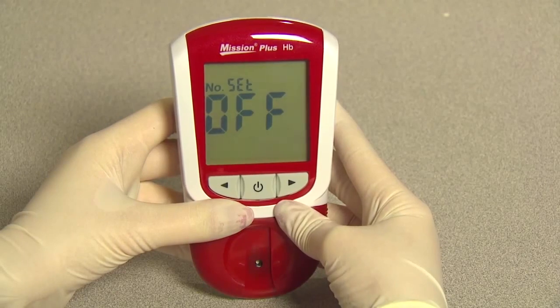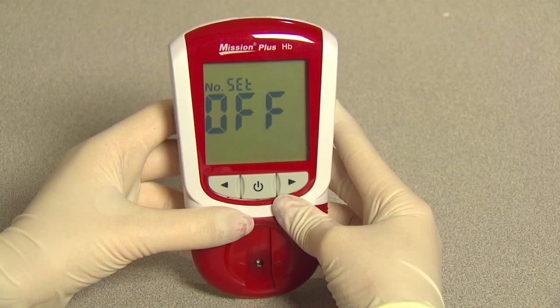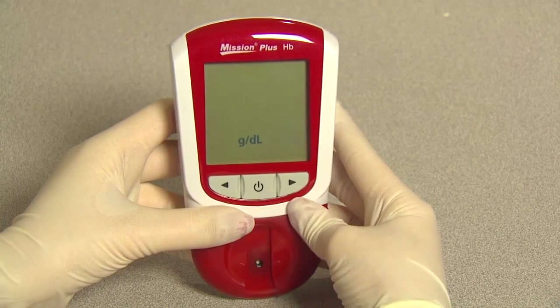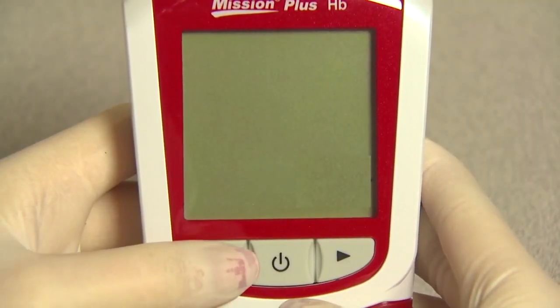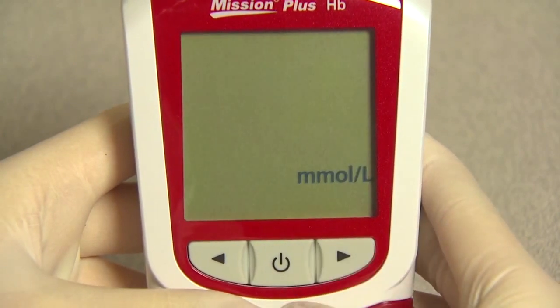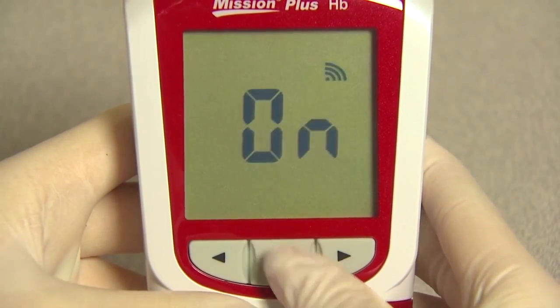Press right or left to turn the test number reset on or off. The test number will reset to 1 for each new day of testing when the test number reset is turned on. Press the power button to save and proceed to units setup. Press right or left to select either grams per deciliter, grams per liter, or millimoles per liter. Press the power button to save and proceed to sound setup.